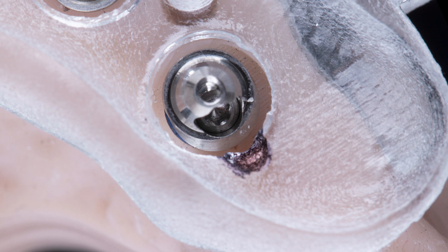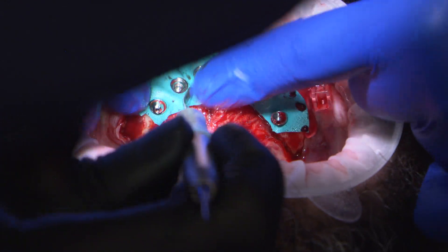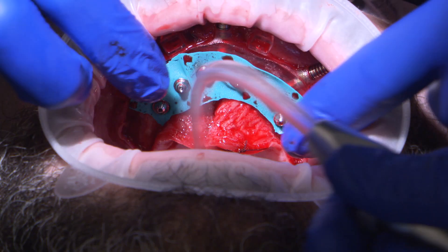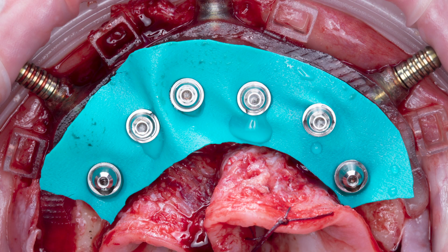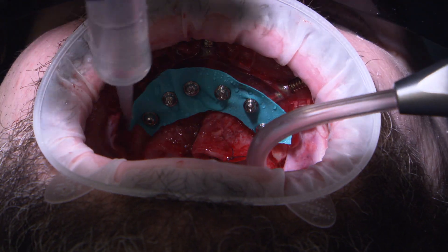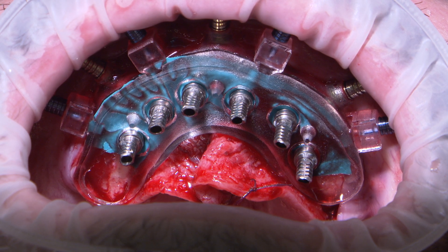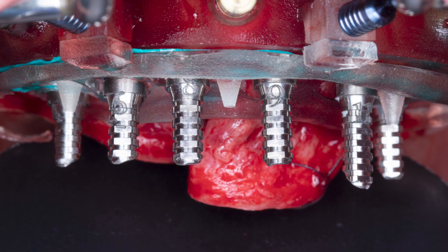The interlocking pins and prosthetic delivery guide were temporarily removed, allowing placement of the gasket. This gasket will protect the surgical site while picking up the immediate fixed screw-retained provisional, preventing the restorative acrylic from contaminating the fresh surgical site. Once the gasket is in place, the prosthetic delivery guide with the blue interlocking pins are reinserted. The laser-labeled pre-cut temporary cylinders provided with the case were then seated in the appropriate position and hand-tightened into place.